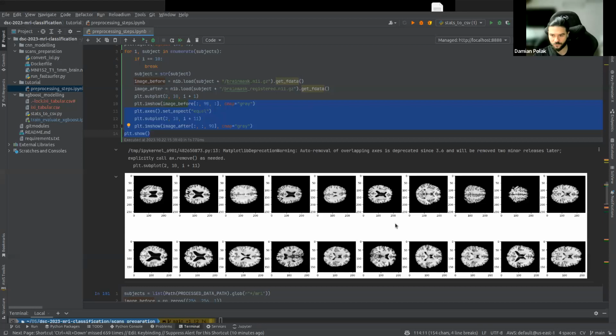How does it work? The registration algorithm finds characteristic points in a scan based on anatomical structure. Then it is transformed to match the atlas as closely as possible. You can define which operations are allowed in the matching process. This is called degrees of freedom.